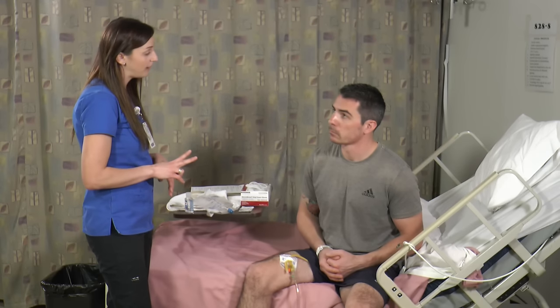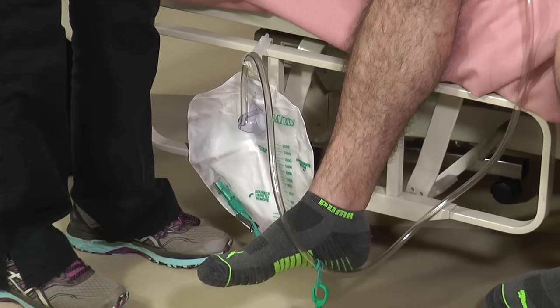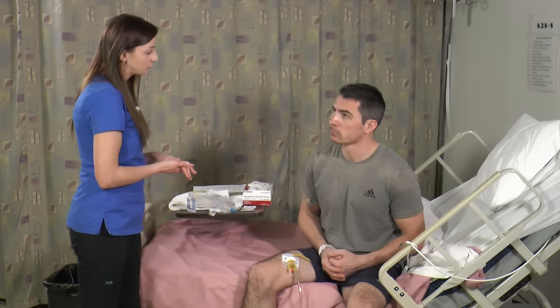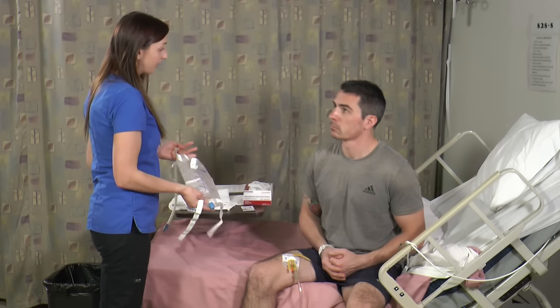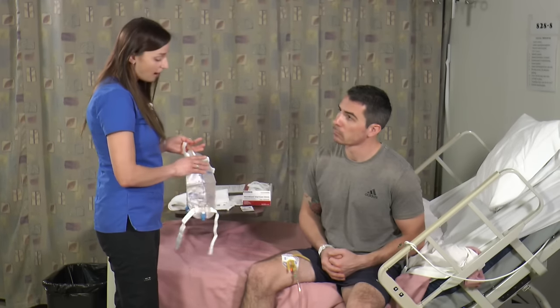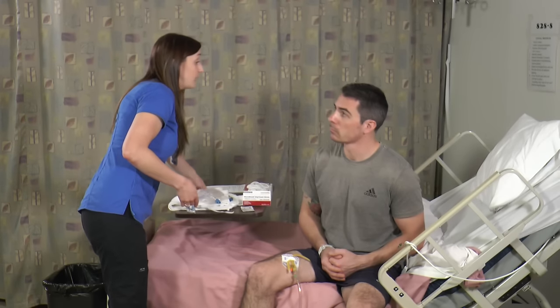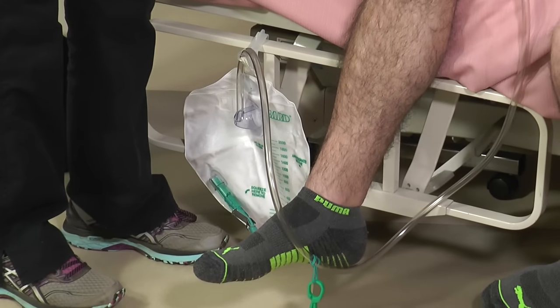All right. So the first thing I want to explain to you is that I'm going to be sending you home with two different bags. The first bag is going to be the gravity bag that you have had at the hospital. I'm going to send you home with a brand new one in order to reduce the likelihood of infection. Okay? And I'm also going to be sending you home with what's known as a leg bag. Now, the differences between these bags are that the gravity bag can be used at any time. And you want to just ensure that the gravity bag is at all times below the level of your bladder, but still off of the floor. You never want the tubing or the bags to be touching the floor.